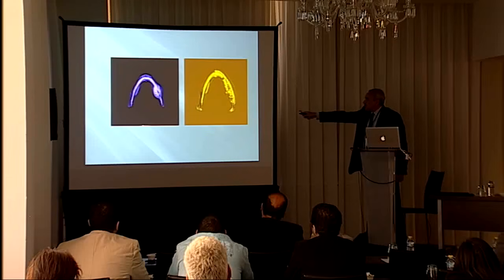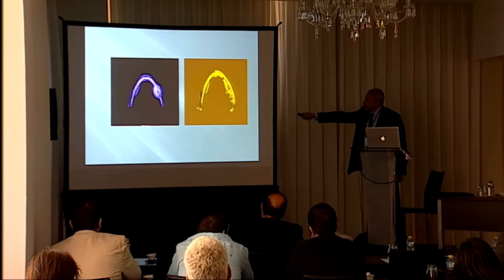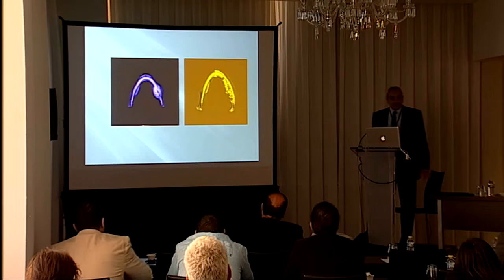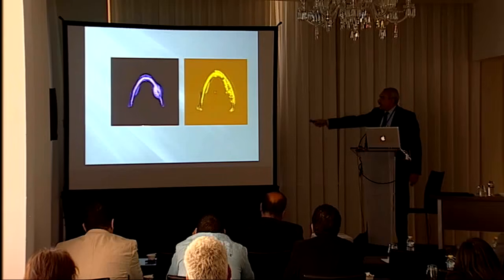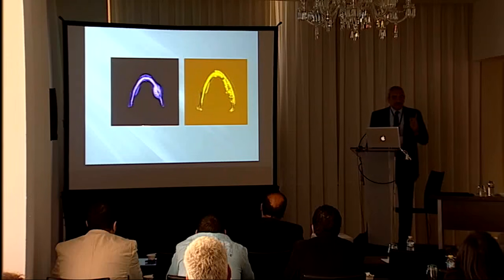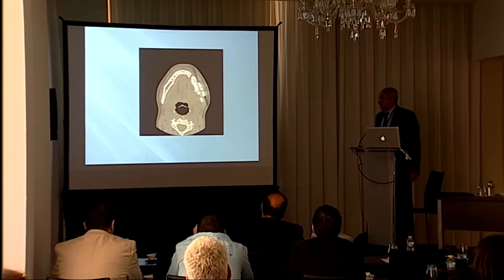And when you take a measurement from the inside of the reconstruction plate to the outside of the mandible here, and you draw a vertical line and measure, you would be surprised that you can have like 83 millimeters here and 84 millimeters on the other side, and the symmetry is outstanding actually.